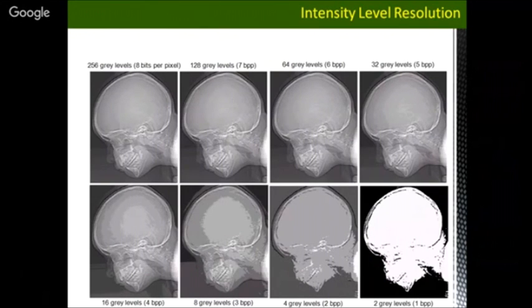That is because imaging the human body requires seeing tissues as hard as what we call dental enamel, or next to that, skull-level hardness. So medical imaging may require more than 256 shades or gray levels.